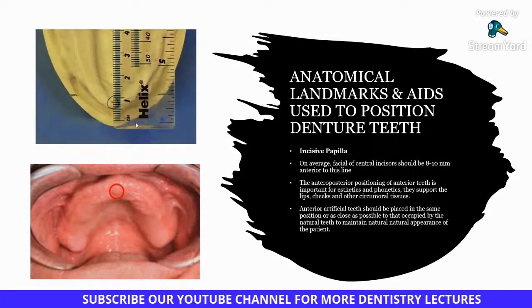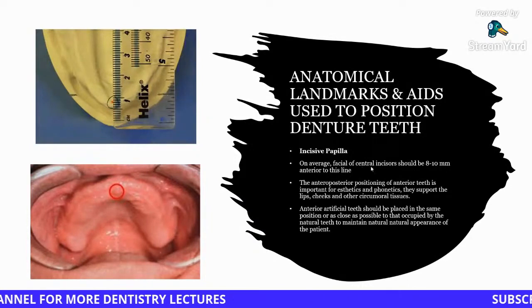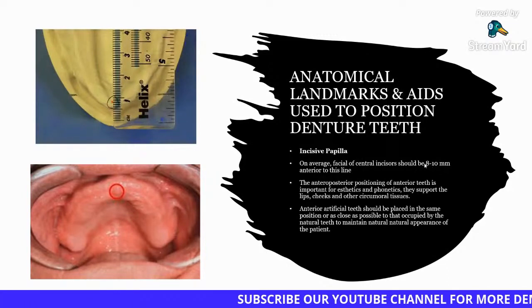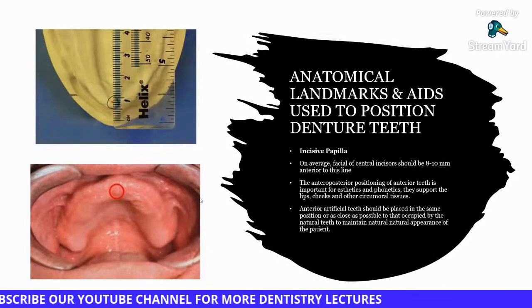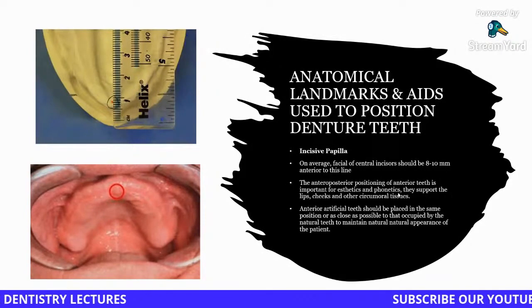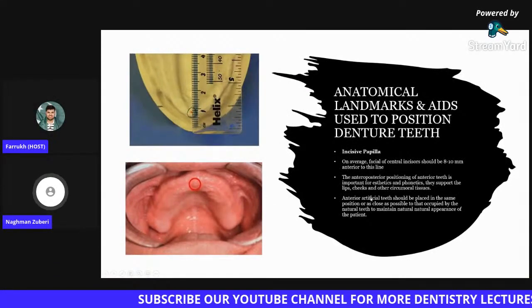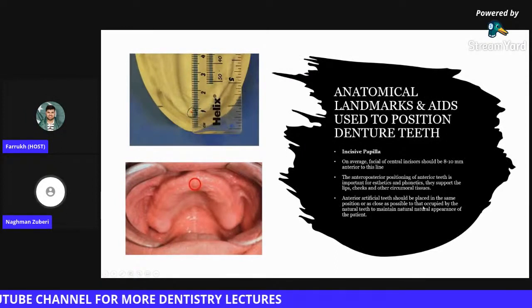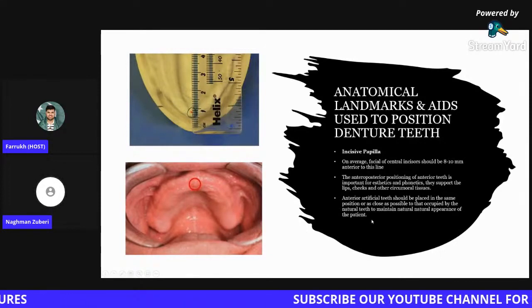The incisive papilla guides us in setting up our anterior teeth. On average, the facial of the central incisors is, as some authors say, 7 millimeters, and other authors say 8 to 10 millimeters, anterior to this line. The anterior-posterior positioning of the anterior teeth is important for aesthetics and phonetics. They support the lips, cheeks, and other circumoral tissues. Anterior artificial teeth should be placed in the same position as, or as close as possible to, that occupied by the natural teeth to maintain the natural appearance of the patient.